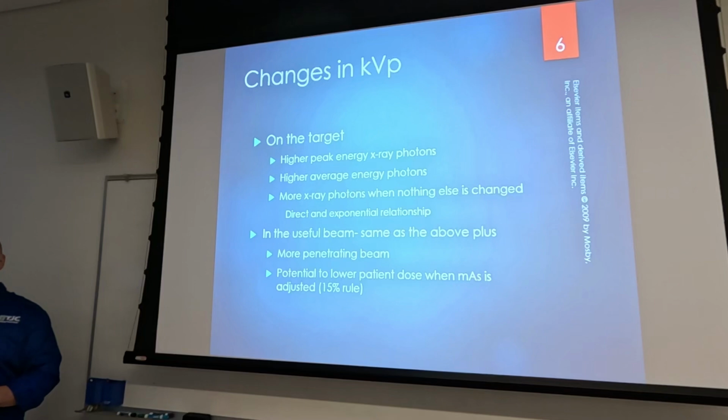Okay, so if you shoot an abdomen at 50 kVp, you're going to penetrate the patient? A little bit, maybe. You will penetrate them. In that case, it might be an ugly x-ray. You can penetrate a lot of stuff, more than what you think you can at 50 kVp. You really can. Play around with it in clinicals. Just pick some stuff to shoot.